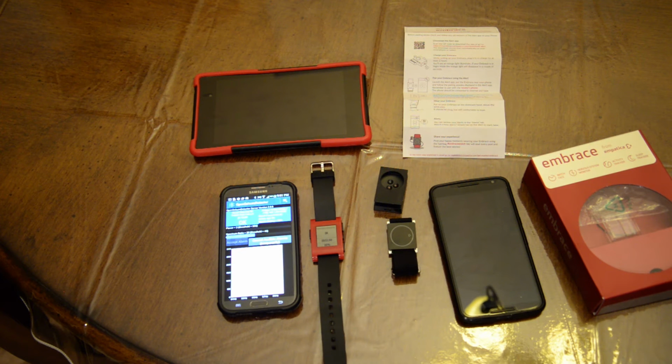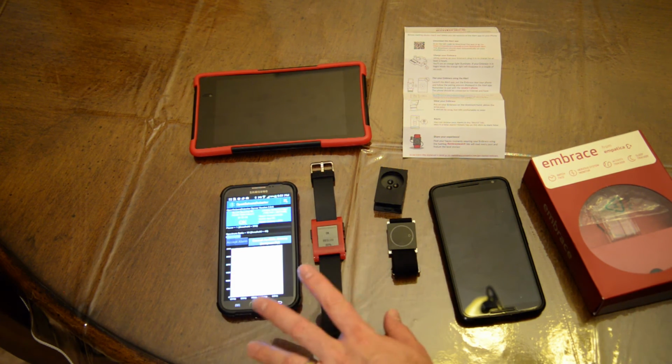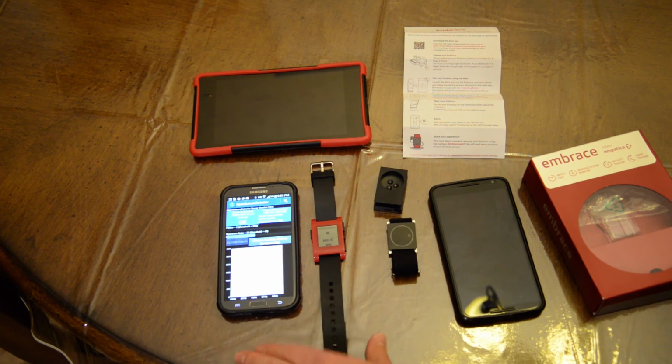Right now we only got a false positive. That means that the seizure that it picked up wasn't a seizure. A false negative is bad. You definitely don't want any false negatives in any of these systems. That means that the subject or the child or your son or daughter had a seizure, but these devices didn't pick it up at all. This one has not given us a false negative. It's always given us a false positive. And a false positive is always better than a false negative, right?